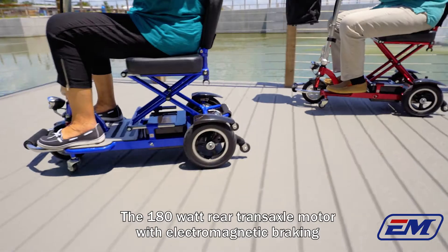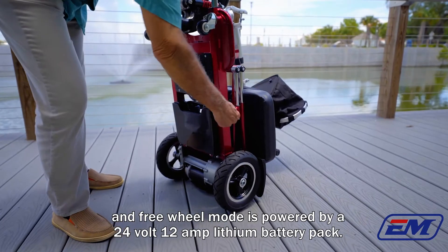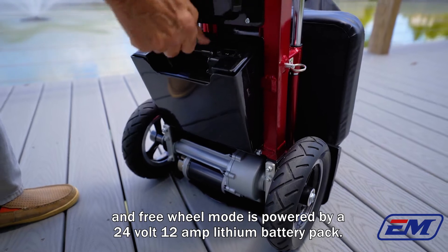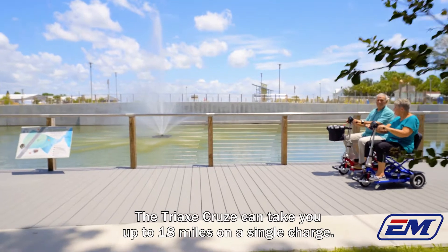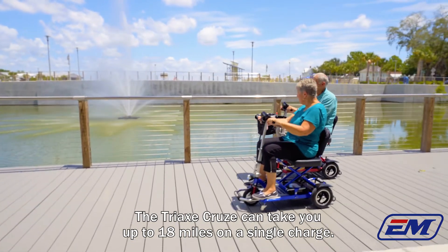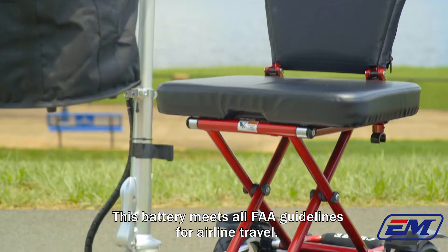The 180-watt rear transaxle motor with electromagnetic braking and freewheel mode is powered by a 24-volt 12-amp lithium battery pack. The Tri-X Cruze can take you up to 18 miles on a single charge. This battery meets all FAA guidelines for airline travel.